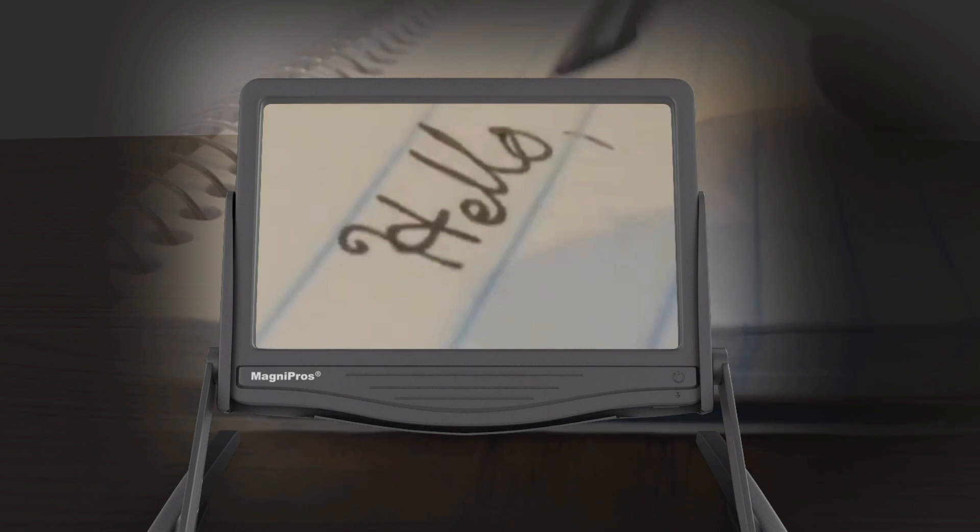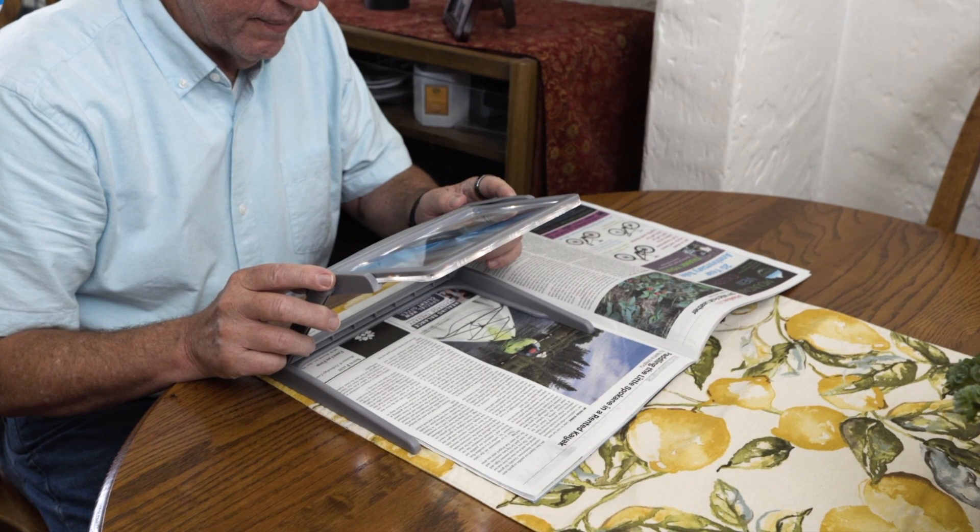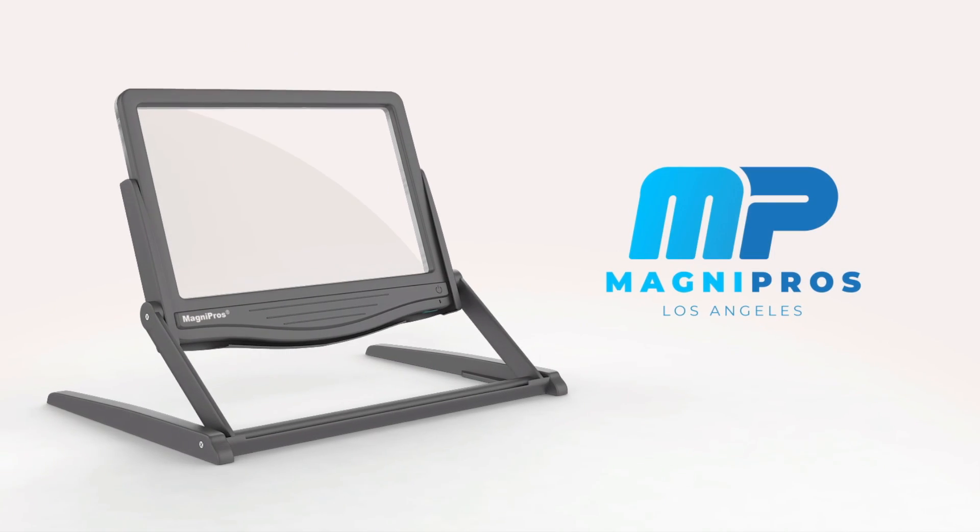So if you just need help seeing small text in a document, or working on your next craft project, or wanting to read a good book, Magni Pros is always here to help. Magni Pros — seeing things differently.